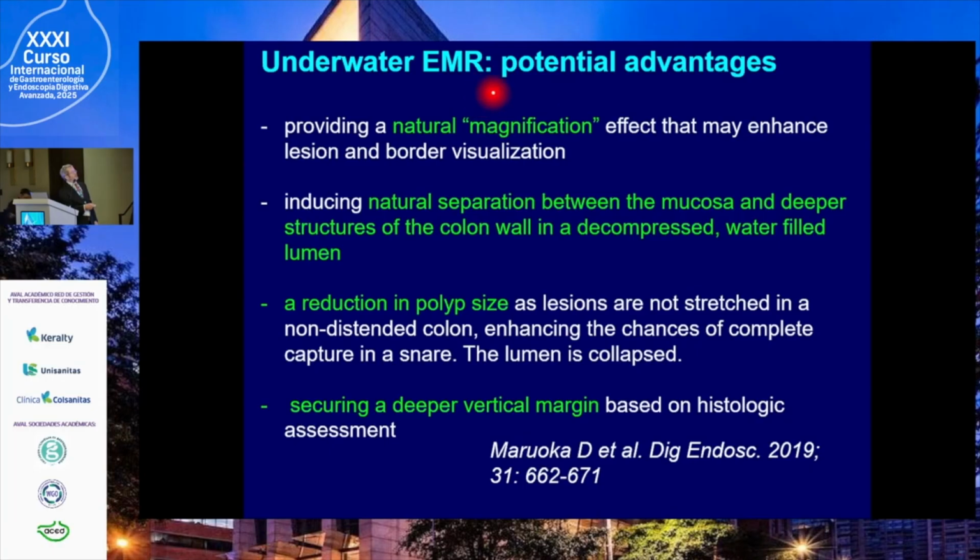You better see the lesion, with natural magnification because of the water. You have a natural separation between the mucosa and the deeper structure, for example, the muscular layer. In fact, there is a reduction in the polyp size, as you saw, okay, thanks to the lesion floating in the lumen, and you secure a deeper vertical margin. So these are different advantages of underwater EMR. Underwater EMR, in my unit now, is the gold standard.